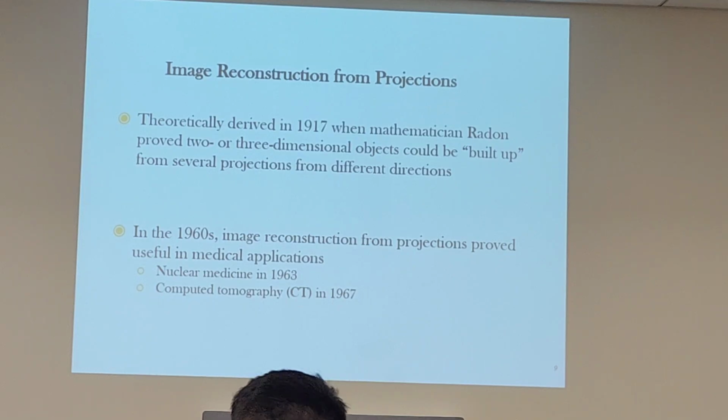Come on. Different anatomy. But what does that mean? How do you answer my question? Why can't I reconstruct the leg, Romer, if I scanned the chest? The information is not there because we never acquired it in data. So you can't make up something if you never acquired the data in the first place.